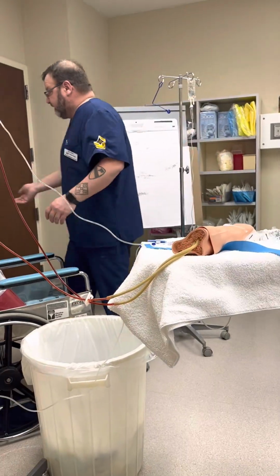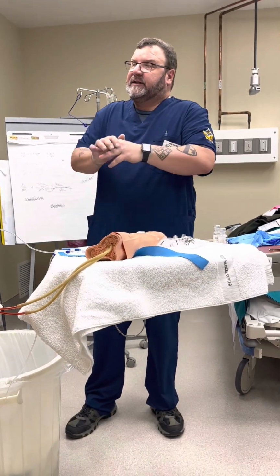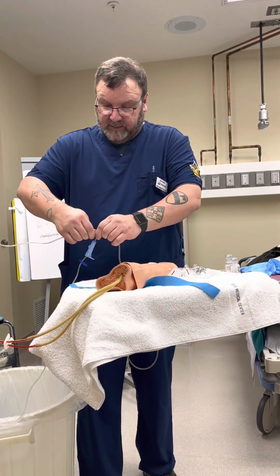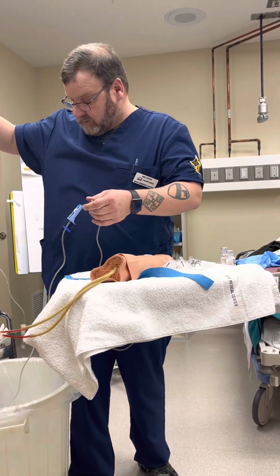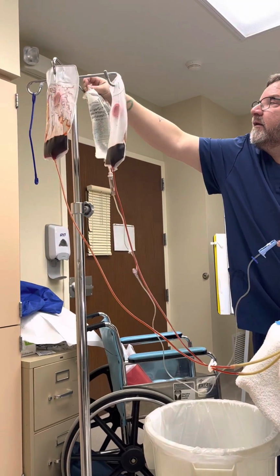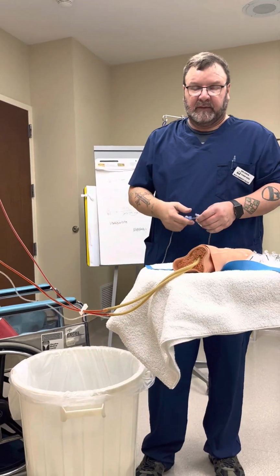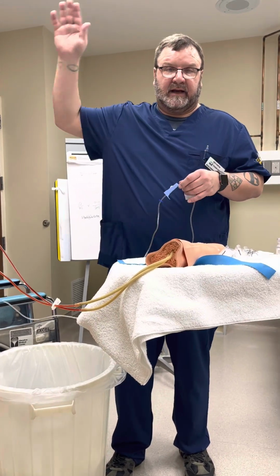So coming back to the patient's room, I will do some hand hygiene. My infusion for my piggyback is complete. So I would close this off, remove the piggyback, dispose of that, put my main line back, and reset my drip rate on my main line and let that run. So my main line is done.